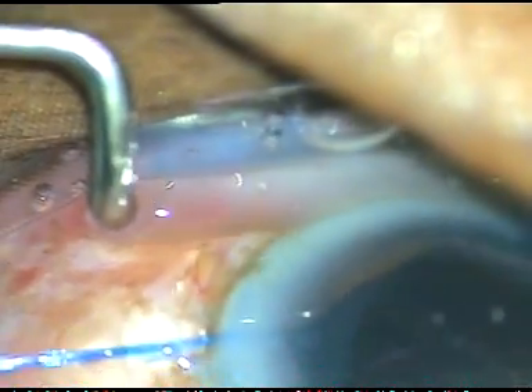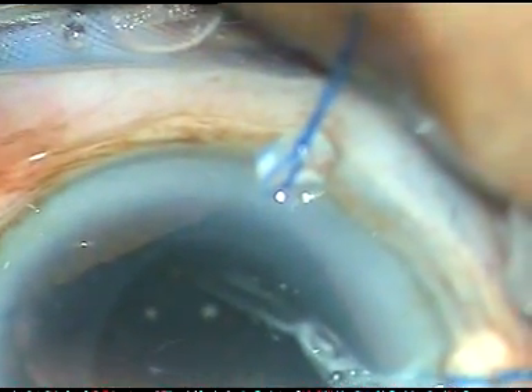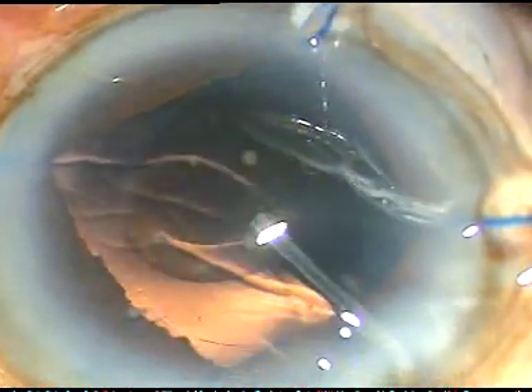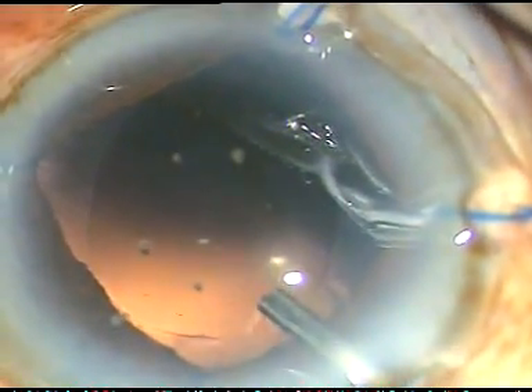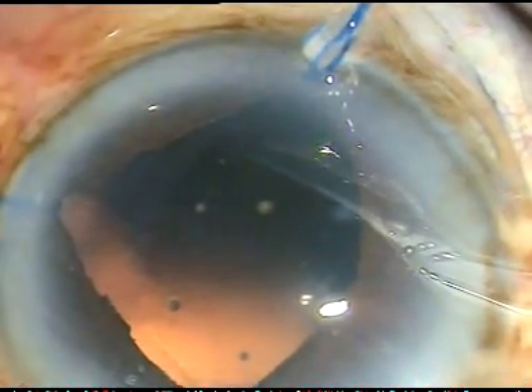The cortical matter has been cleaned and removed nicely, and I am very happy that the posterior capsule is very nicely cleaned. There are no cells on the posterior capsule. Now I inject viscoelastic substance, fill up the anterior chamber and fill up the capsular bag. In this case I have selected a hydrophilic acrylic intraocular lens because the patient belongs to an economical category.